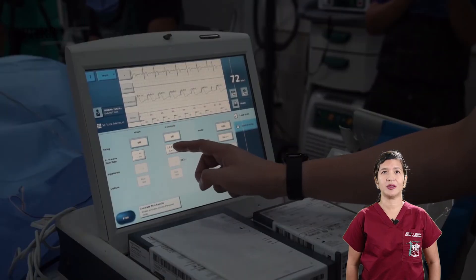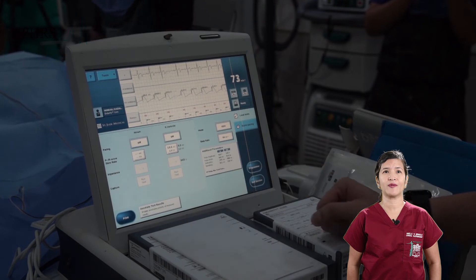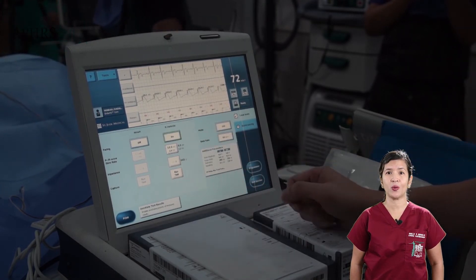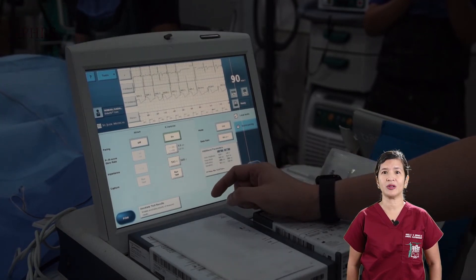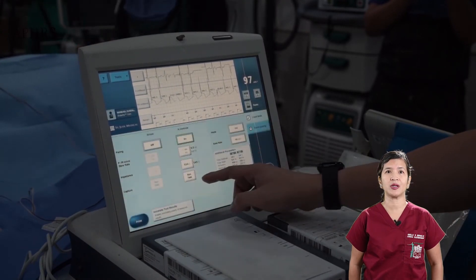RV lead testing is conducted in three parts. The first is the measurement of the R-wave in millivolts. A minimum of 5 millivolts is required, although 10 millivolts would be excellent. The presence of an injury pattern denotes good contact between the screw and myocardial tissue.